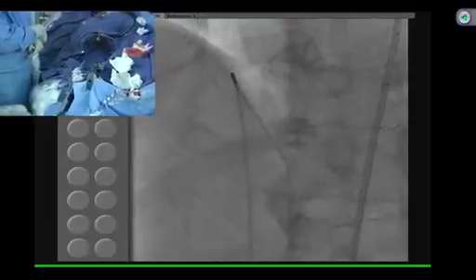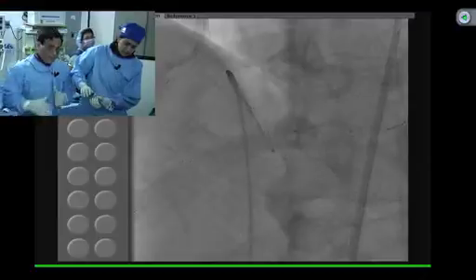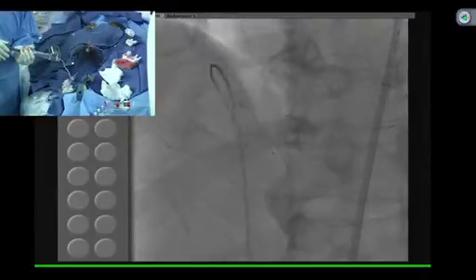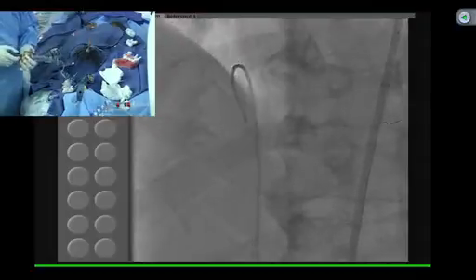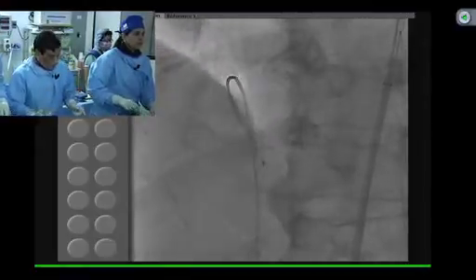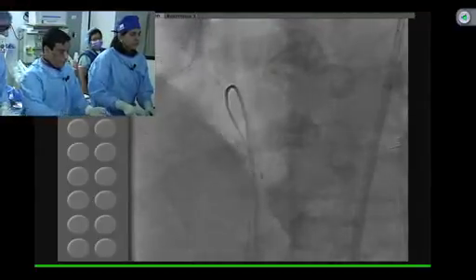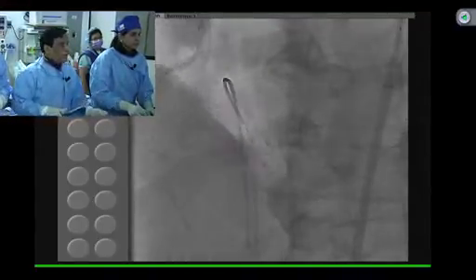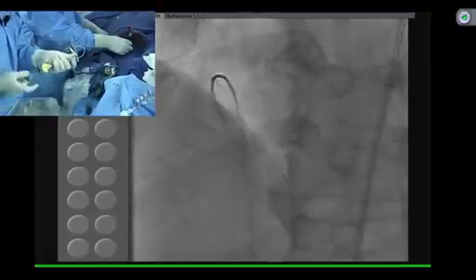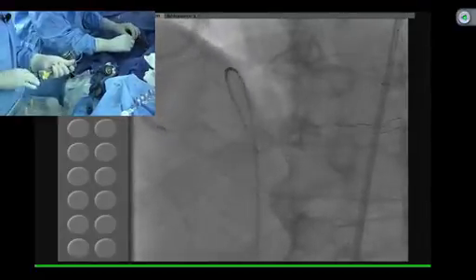Because by and large, what is the incidence of a patient going for a PCI CABG or even elective CABG because your PCI failed in the acute time period, not the restenosis? I would say I don't know any case we have. So that's extremely, extremely rare, and from the logistics point of view, it is better. You want to dilate the mid lesion at least? Yeah, once, go. Yeah, from the logistics point of view, it is better because you have less procedure time and less additional contrast volume. So that's why basically I said, and this is what we practice at present.